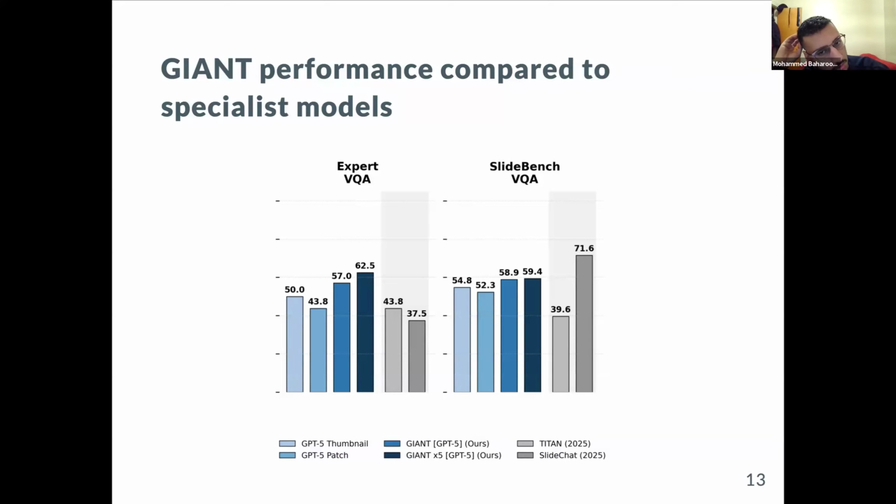I would assume if you provide the model the report from the TCGA dataset and make it answer questions from expert VQA, would it be able to answer it? Yeah, that's a good question. Probably not, because we didn't give the pathologist the report or even the label. We just had them look at the image and interpret it on their own using their expertise and generate a question about the image. So there wasn't any constraint that these questions would be found in the report. It's very likely that if the model had the report, it wouldn't really help with these questions.